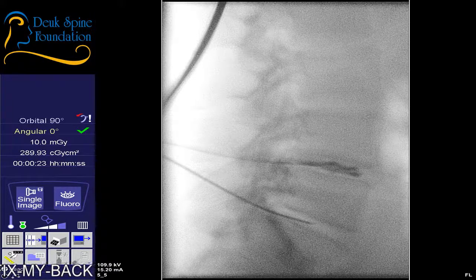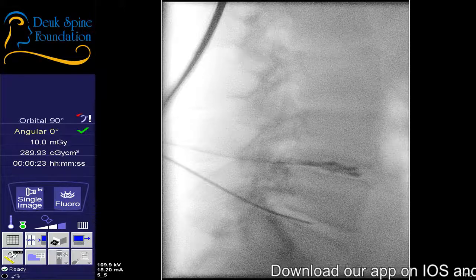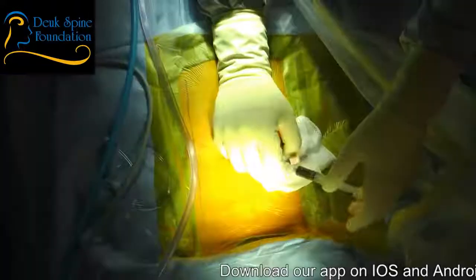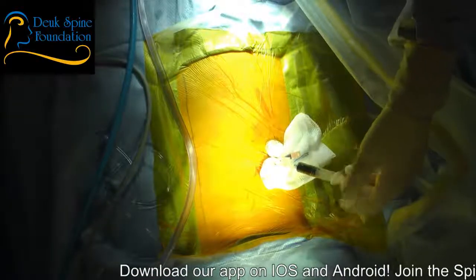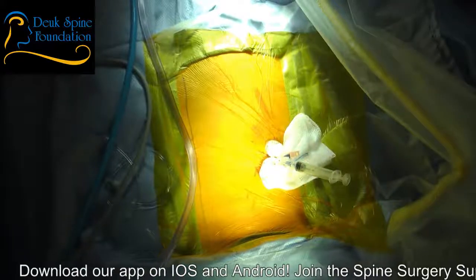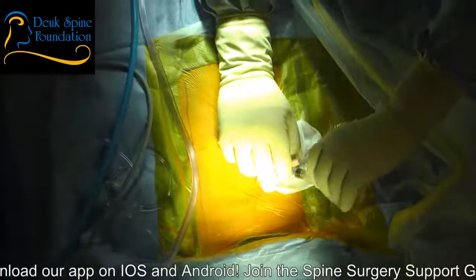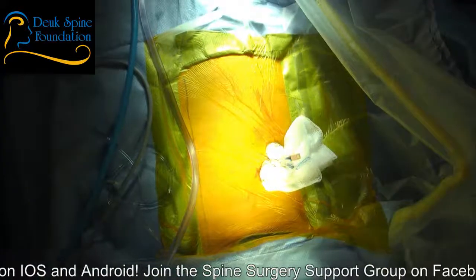All right, we found one of your bad discs, okay? We're going to get that fixed. I'm going to put you to sleep in just a minute now. I need your help just for another minute. So I didn't tell the patient I was injecting anything in their disc, and you all saw how he reacted, I hope. He really felt a lot of discomfort, because I tested the L4-5 disc. L5-S1, it just comes right out. Okay, you can go to sleep now. When you wake up, we'll be done.